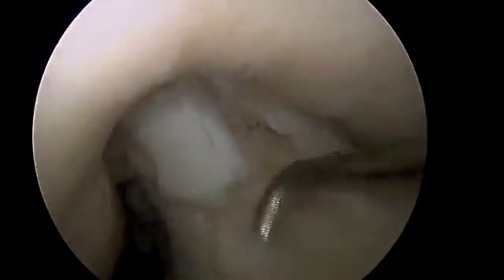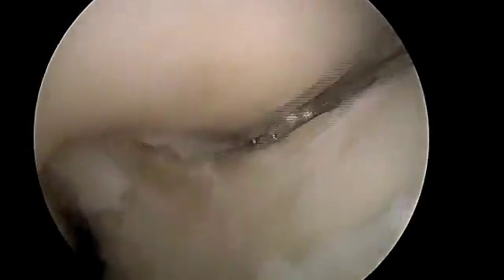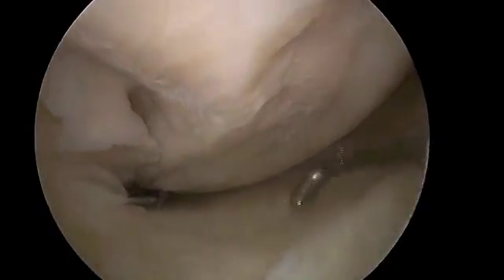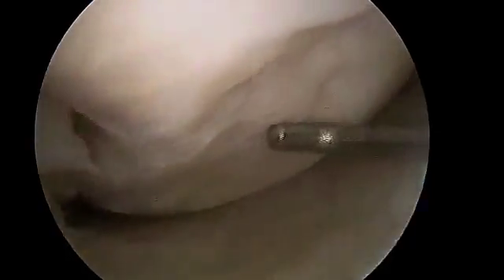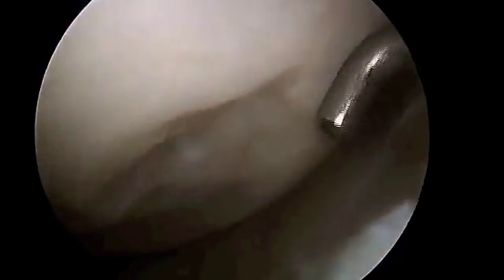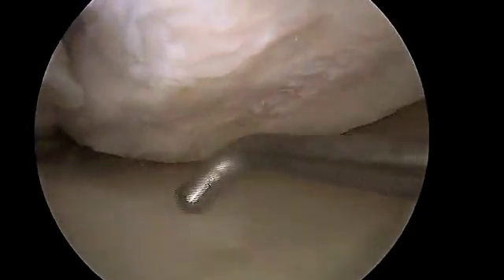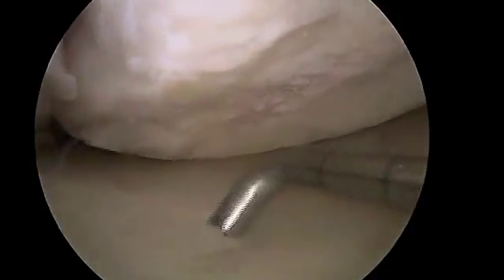Again, using the metal probe to feel and make sure there are no unstable portions — anything we might need to address at a later time. The notch of the knee there — there's the anterior cruciate ligament, and that looks fine. As I bend the knee down, you can see on the medial side the articular surface defect. But we've taken all the unstable articular cartilage off, preventing any further loose bodies, and we've taken out the torn portion of the meniscus. We've got a stable tibial plateau bed.